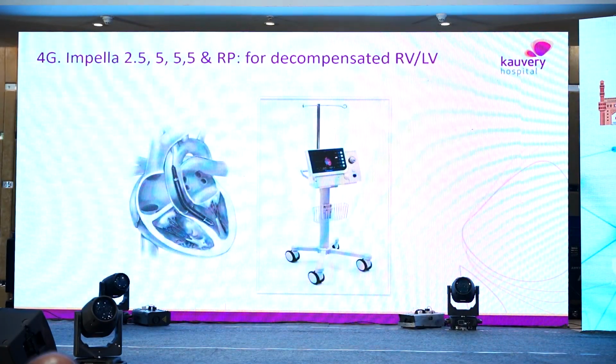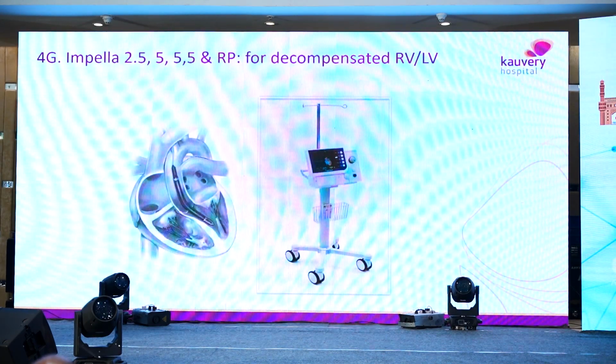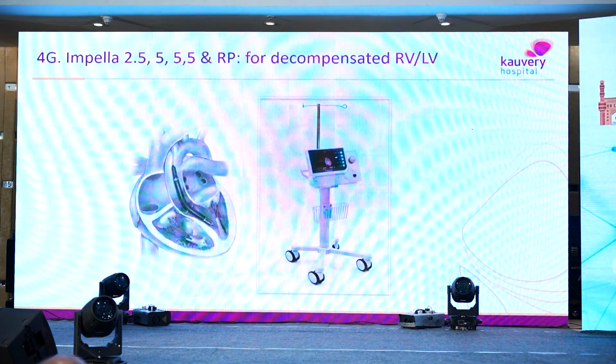This is something that we are increasingly using in the setting of a heart, where it can be used on the left side as well as the right side. This is shown on the left ventricular Impella mechanism. This is percutaneously implanted by the cardiologist and can deliver 2.5 liters per minute. If you want more than that, then it has to be surgically implanted by the cardiothoracic surgeon.